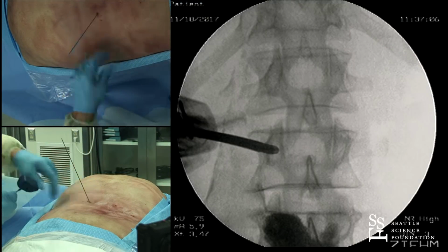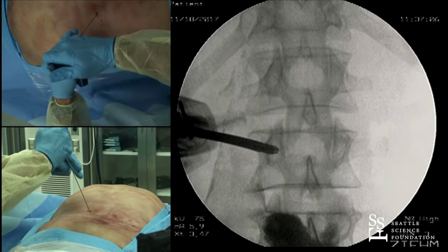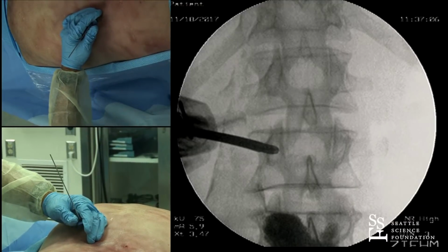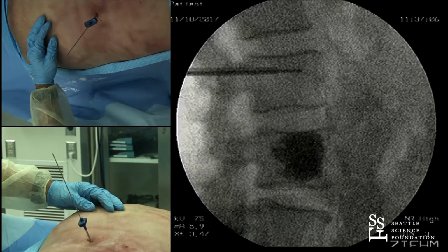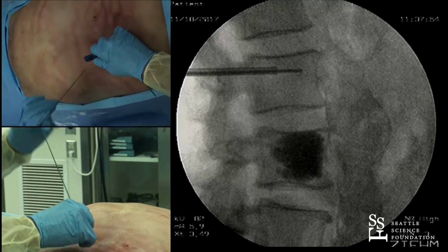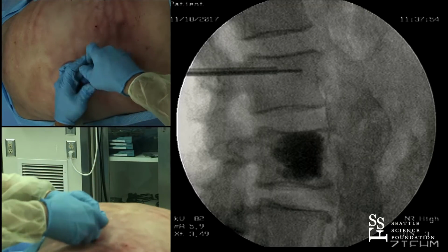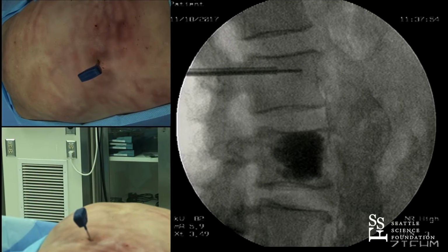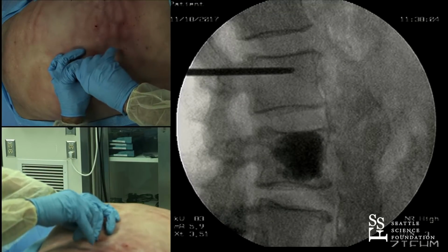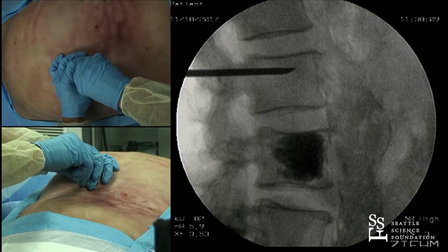And I'm going to go for my unidirectional needle once again. I'll put this back in. Make sure we're back into the posterior portion of the vertebral body. I'm going to remove the K-wire, put the unidirectional bevel back in. He will pull it back to the base of the pedicle, posterior portion of the vertebral body, and he'll increase the angle. So he's aimed more toward the center.